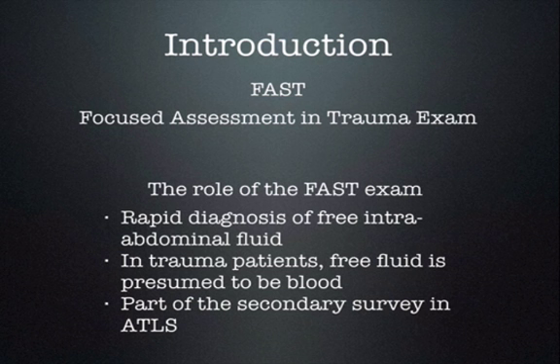Clinicians who use ultrasound in their daily practice can use the FAST exam not only for trauma, but for many other indications. However, we will focus on the trauma applications in this lecture.